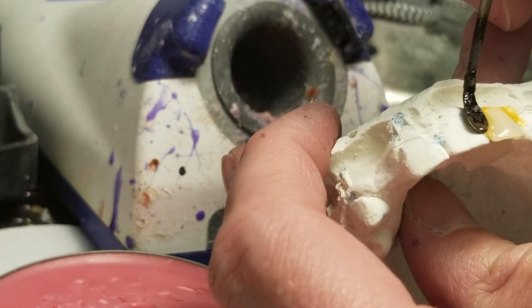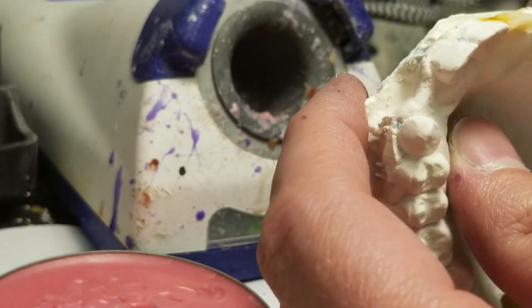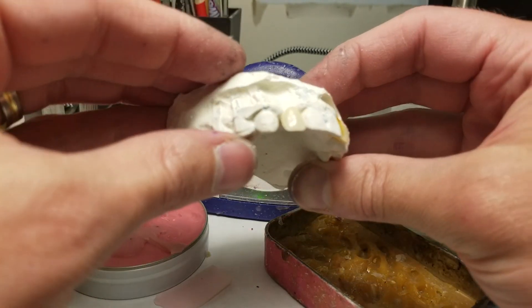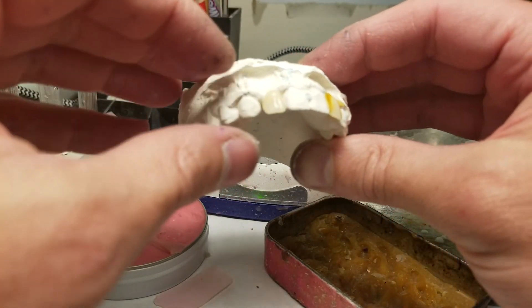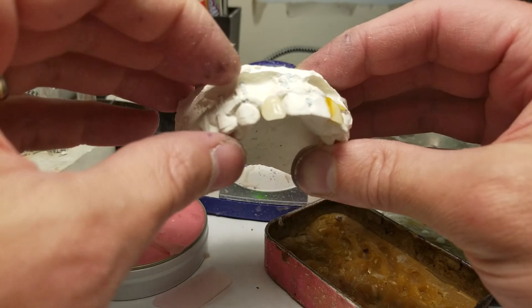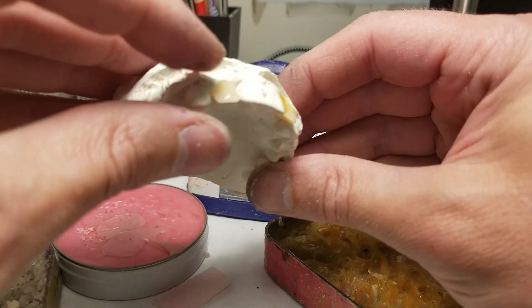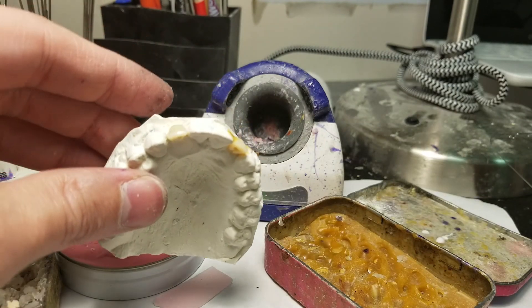Alright, I'm happy with that. Let's attach the other one. I usually try to find a tooth that will span the whole gap, but sometimes the gap is just too wide for a natural-looking tooth, so we'll have to fill it in with some acrylic. I'm ready to tack that down with some sticky wax.